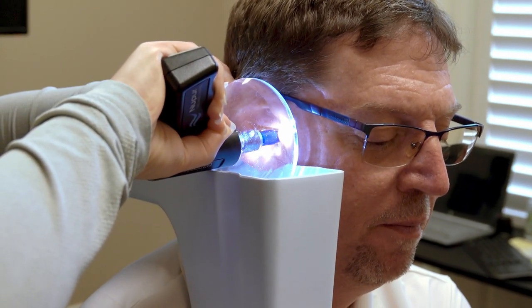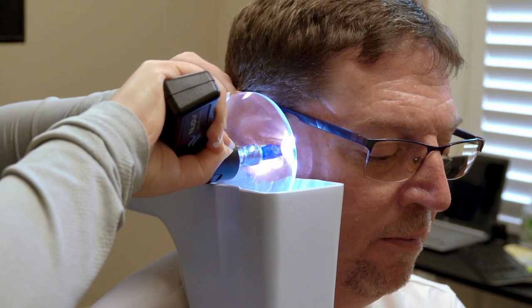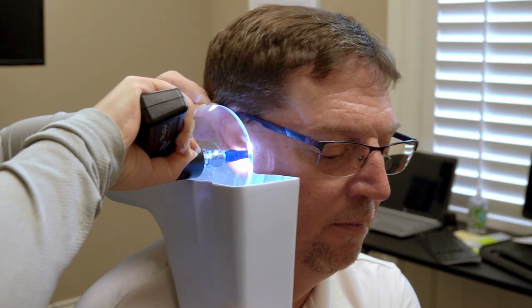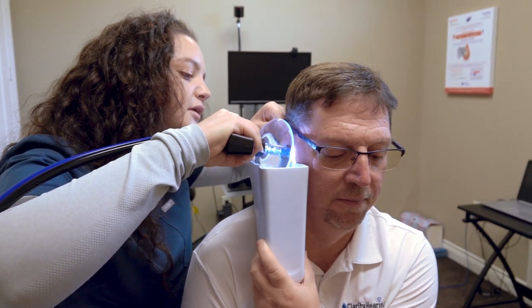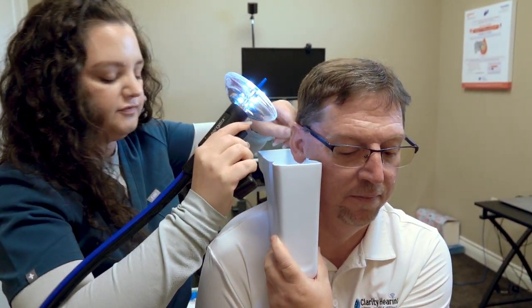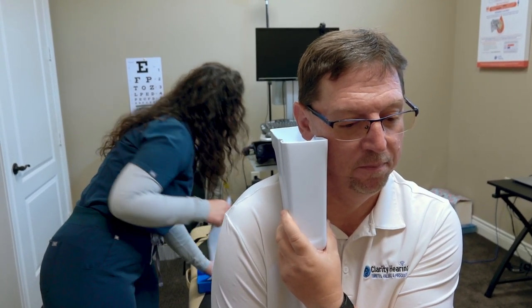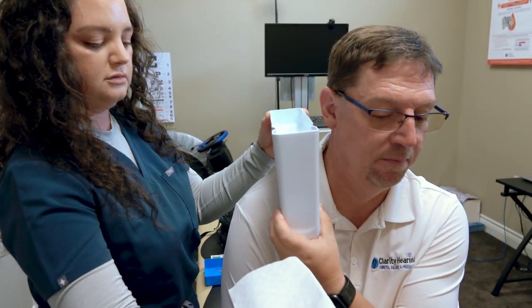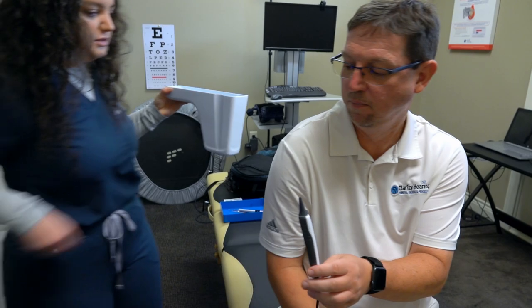One, two, three. How are we doing? Doing great, excellent — got a couple of pieces out already. How are we feeling? Much better. I'm just going to grab this napkin so we can dry your ear a little bit, and then we'll take a look and see. I'll switch so you can grab the napkin. I think that's everything but we'll need to take a look first to be sure.